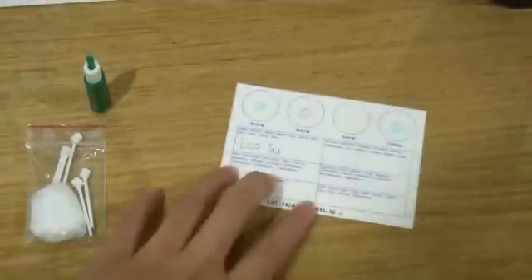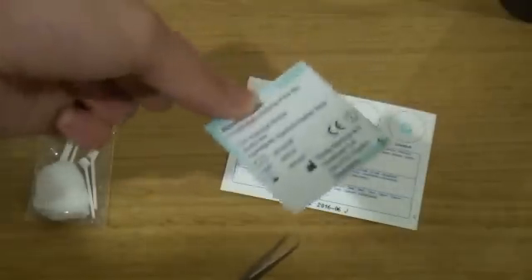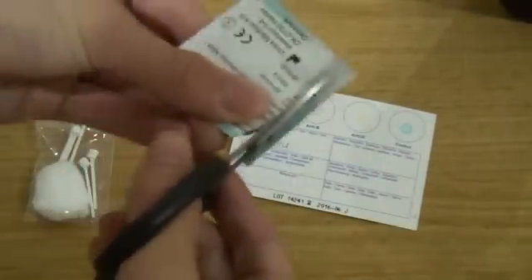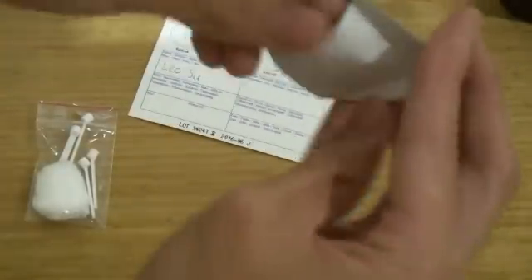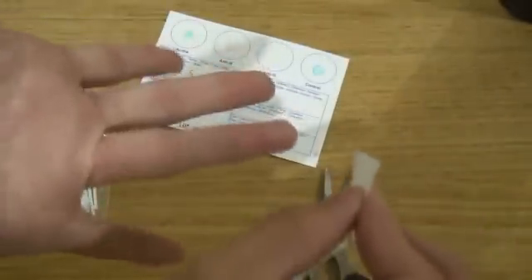We twist the safety cap of the lancet. And here's the alcohol swab — I have to open it. Then you swab the area where you're going to cut, which is my ring finger in this case.